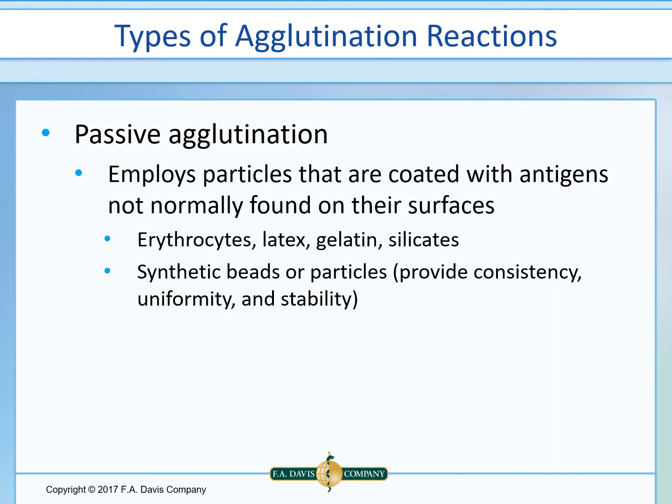These commercial test kits are usually performed on disposable plastic or cardboard cards, or sometimes glass slides, and the kits contain positive and negative controls. So if you don't get expected results with the controls, the test is not valid. These tests are usually screening tests, and then they need to be followed up with more extensive testing or a diagnostic confirmatory test.